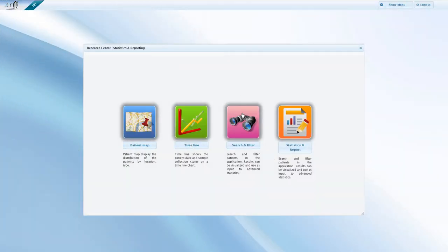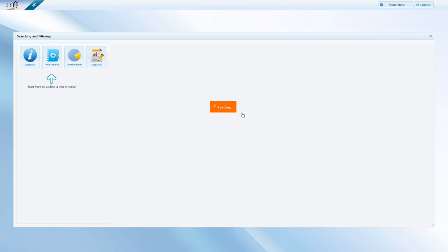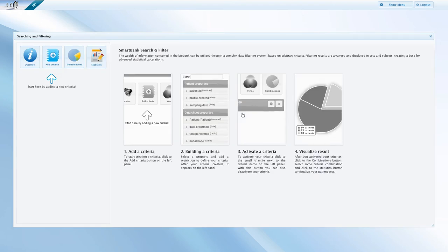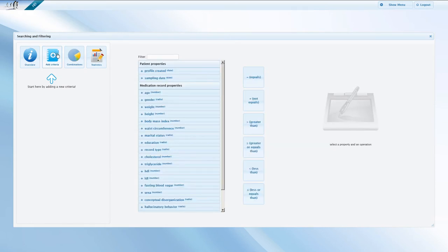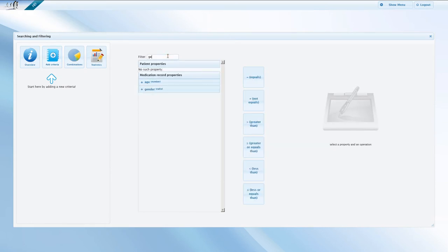Searching and filtering is the part when things get really interesting. In this demo, we first show you how to create a new criteria to filter by sex and find all women in the database. To start filtering the complete database, click on the Add Criteria button. You can pick one of the properties from the list or simply start typing a criteria.